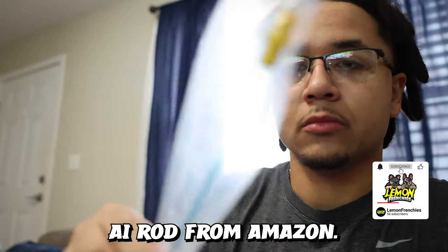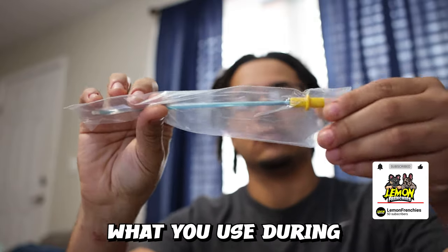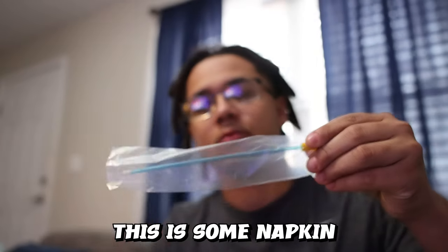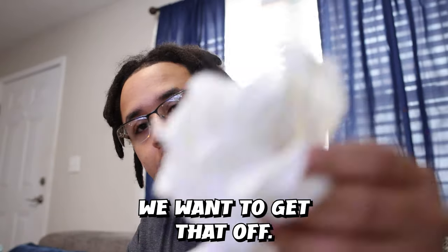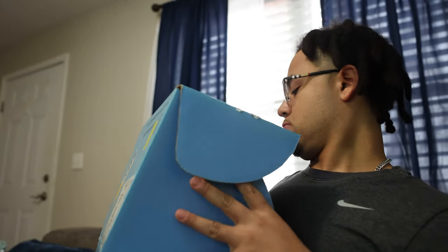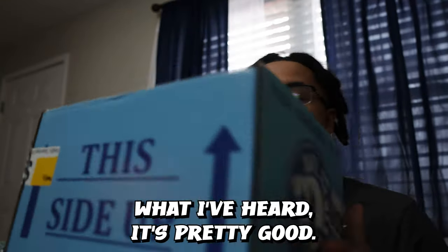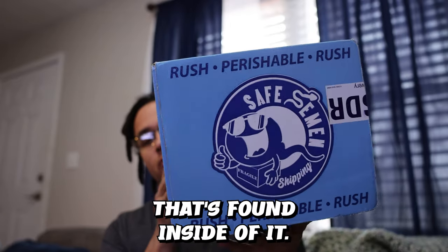We'll start with this 7-inch AI rod from Amazon — it actually came with multiple of them. This is mainly what you use during an artificial insemination. You can also use a catheter, but this gets the job done. This is some napkin to clean off her vulva — any dirt or anything back there we want to get that off. This is actually the box that the semen came in, a safe semen box. Most of the time it has an insulated pad on top, with an ice pack in the middle. This is what a lot of breeders use to ship semen and from what I've heard it's pretty good. You can't really control the temperature — you just have to rely on the ice pack inside.